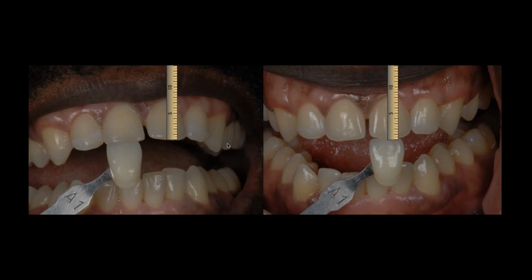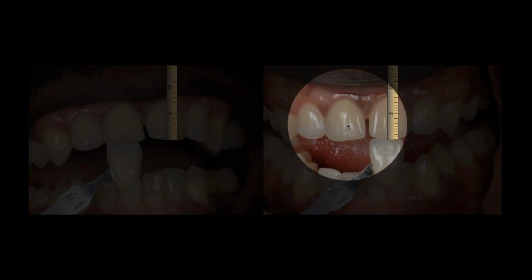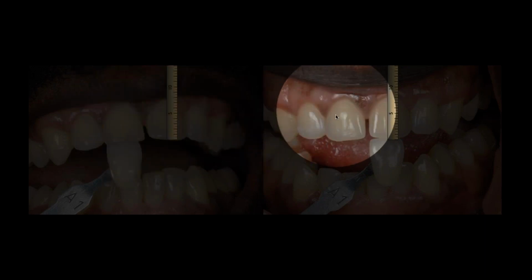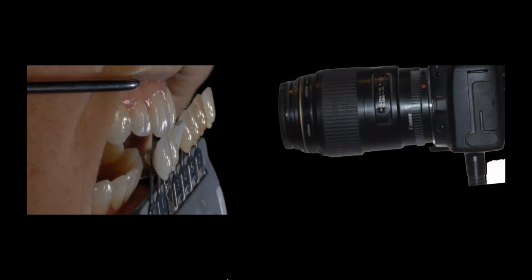The one where the patient's in the chair, look at the coloration on the number 8 as compared to what you see in the coloration here. Look at what you see from a length point of view. Doesn't this tooth appear a little stumpier, a little shorter as compared to what I see here? So just having improper information of how you're taking a photograph skews the information of what we need to start working through our colorization and our systems.